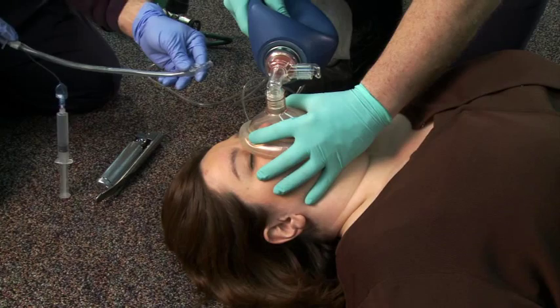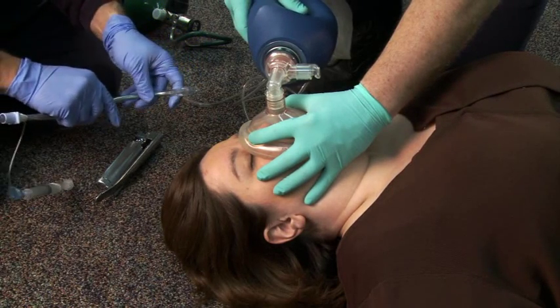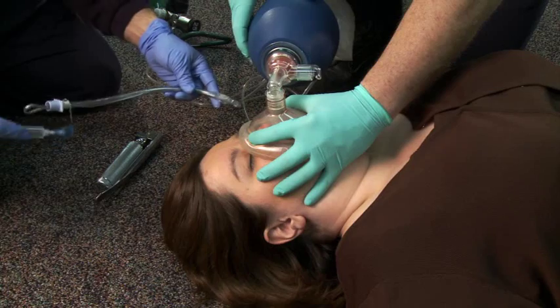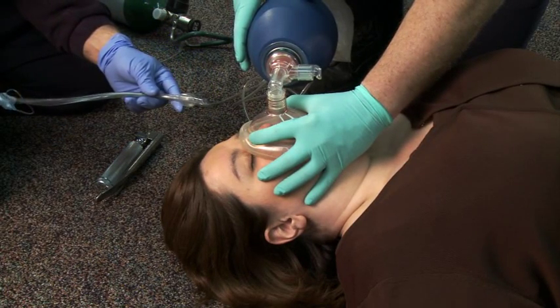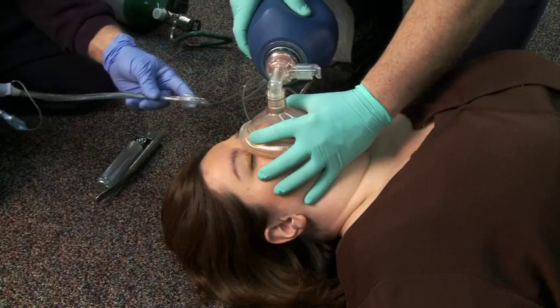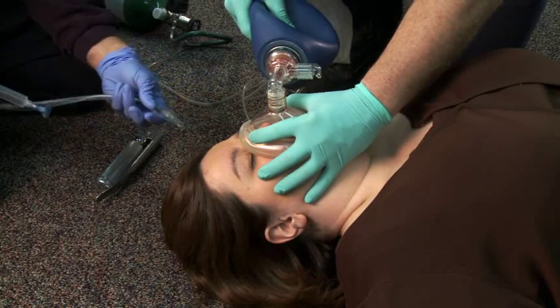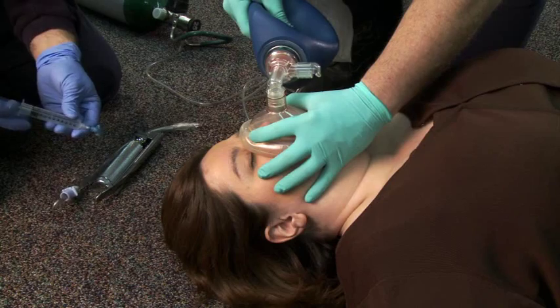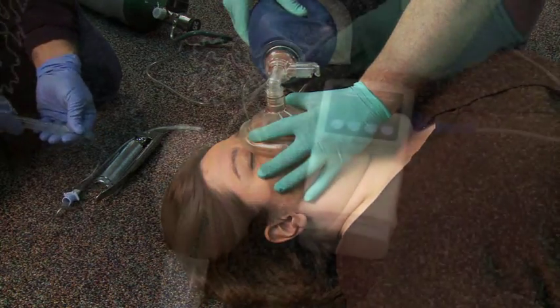Select the proper-sized ET tube based on the patient's size. If a malleable stylet will be used, place it inside the ET tube with the end of the stylet about one-half to one inch from the distal end of the tube. Lubricate the distal end of the ET tube with a water-soluble lubricant.